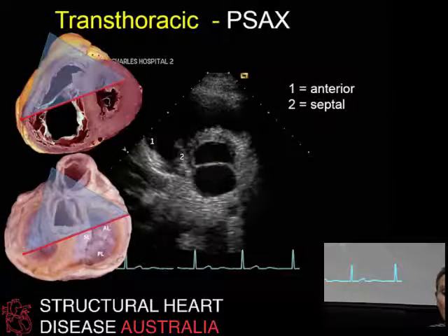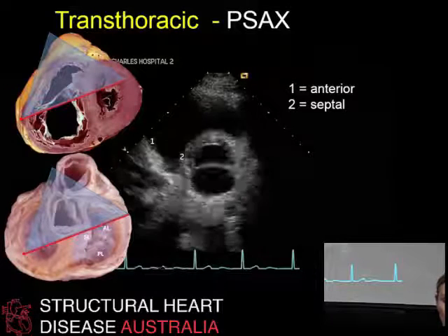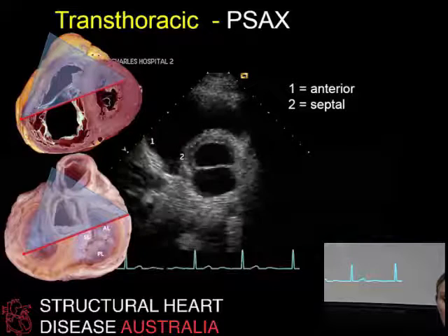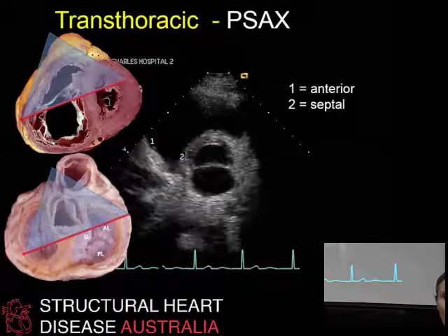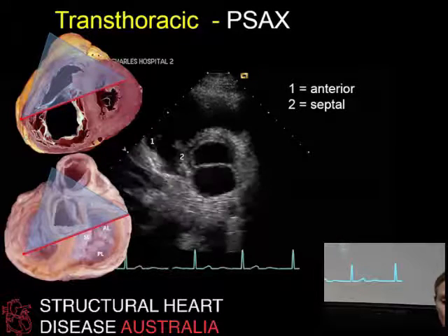In the parasternal short axis view, when the transducer is angled closer to the aortic valve, one can see the anterior leaflet closest to the transducer and the septal leaflet in close association with the septum.